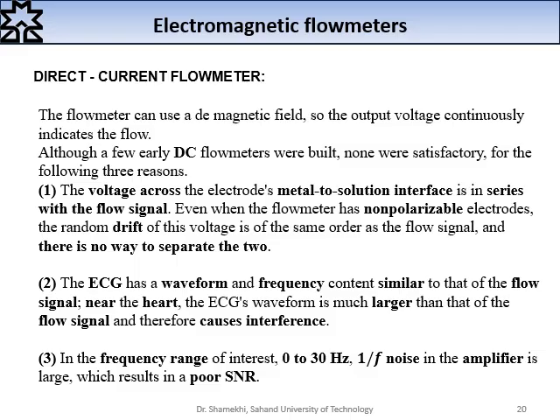Although a few early DC flow meters were built, none were satisfactory for the following three reasons. If I ask you for the reasons or the disadvantages of using DC flow meters, you should answer based on these three reasons.